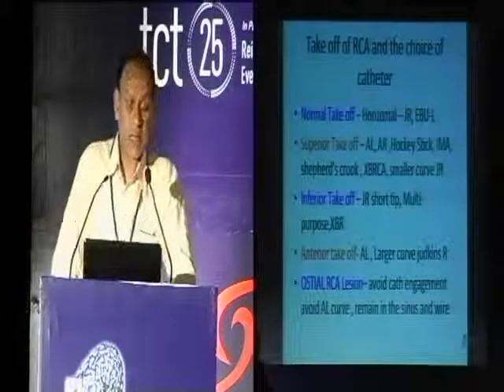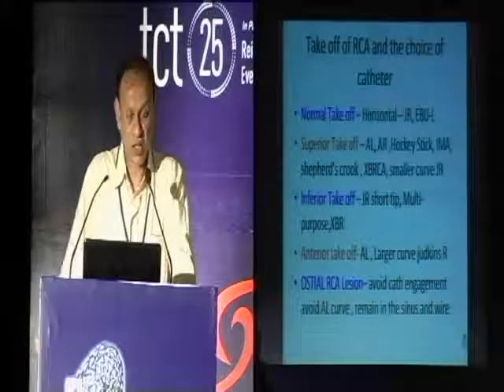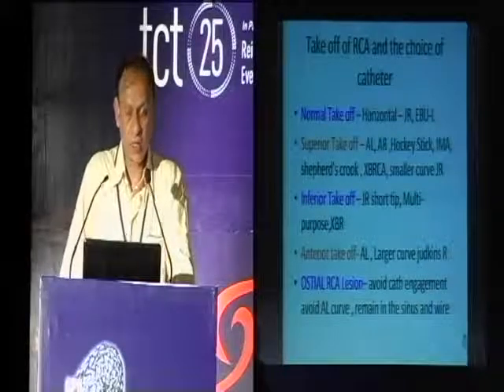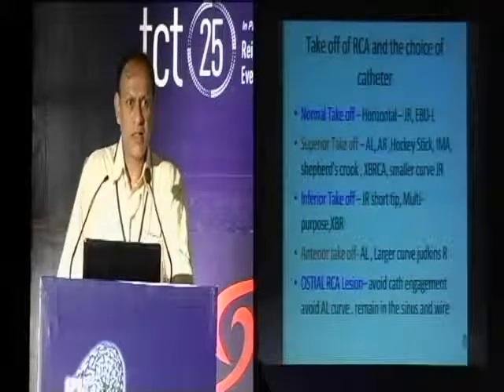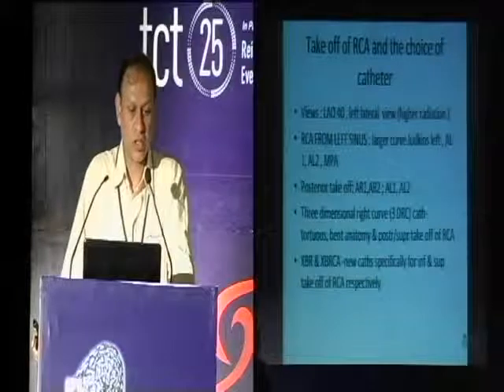In the case of ostial RCA lesions, to avoid catheter engagement of the ostium of the RCA and producing a dissection, we avoid an Amplatz curve and preferably remain in the sinus and try to wire the lesion while remaining in the sinus. That would be a better decision to do.